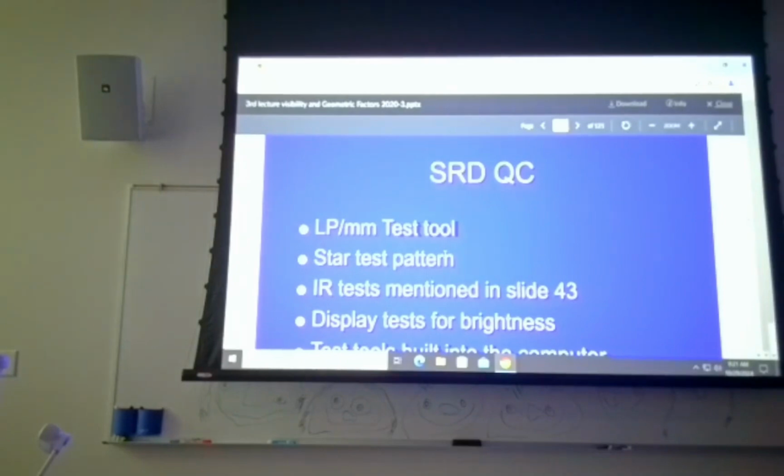So our overall image size is 10 by 12, but if I were to break these pixels up into little bitty individual pieces, now I've got 1, 2, 3, 4, 5, 6, 7, 8, 9, 10, 11, 12, 13. 13 by 1, 2, 3, 4, 5, 6, 7, 8, 9. So it's 9 by 13 instead of 4 by 4. Which one's going to give you a sharper image? 9 by 13. So now you can make out that it's a hand. It's an ugly hand, right? But you can make out it's a hand. On that 4 by 4, you couldn't even tell it's a hand.